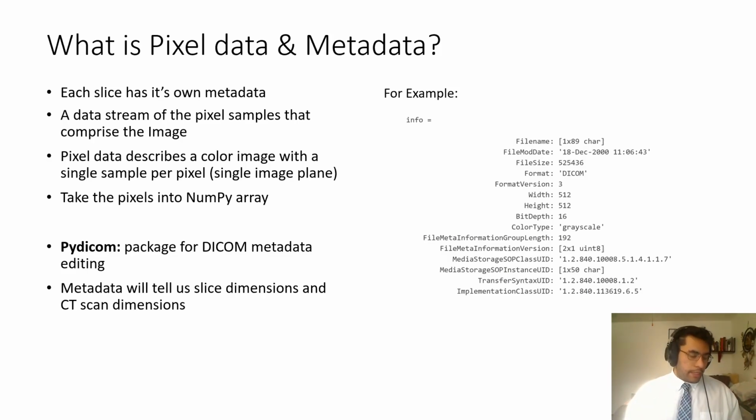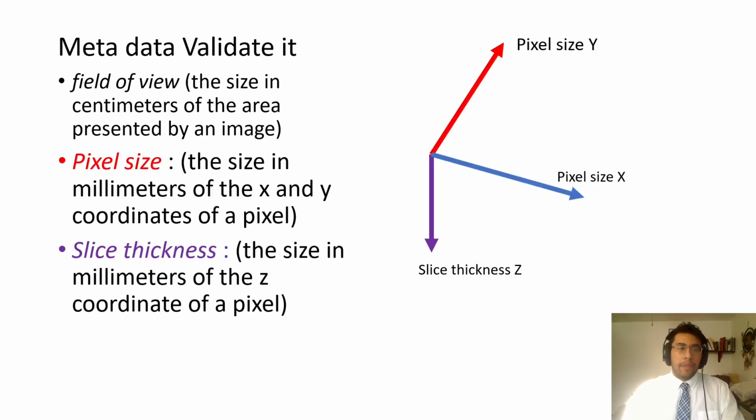Everything that you process into these models is going to be taken into a numpy array, and that's essentially what you need. The Python package we'll be looking at is PyDICOM. It's well developed and kept up regularly, and used by several researchers in general. So they've got well documented code that we use there.